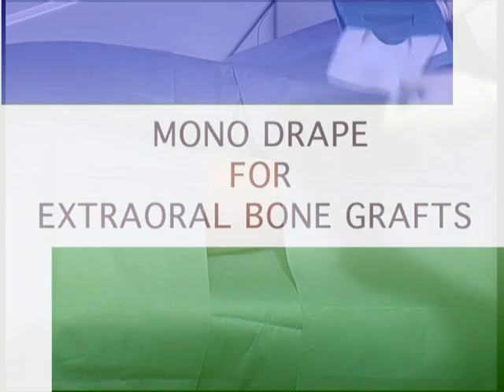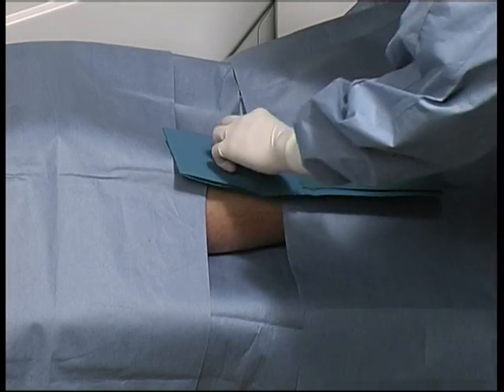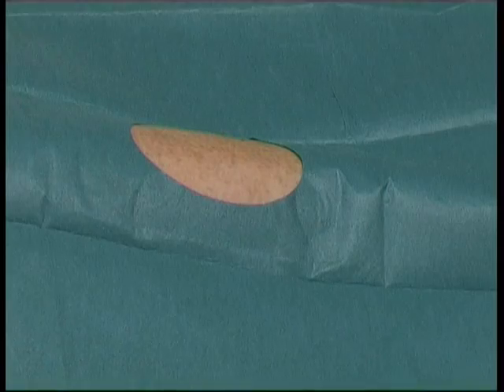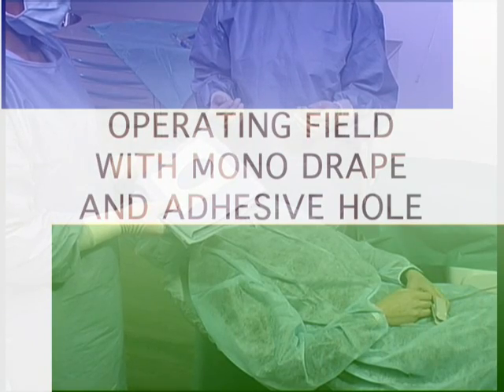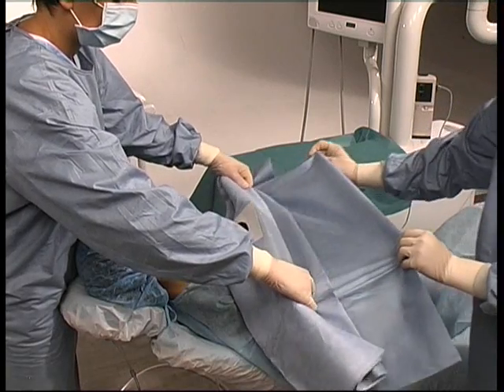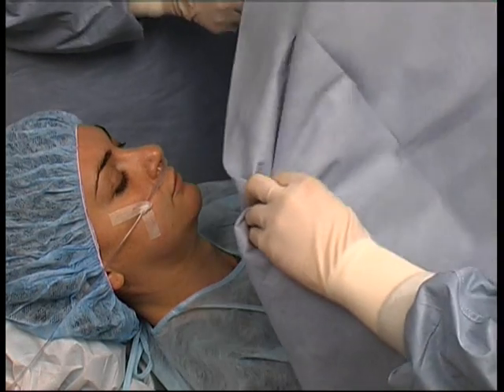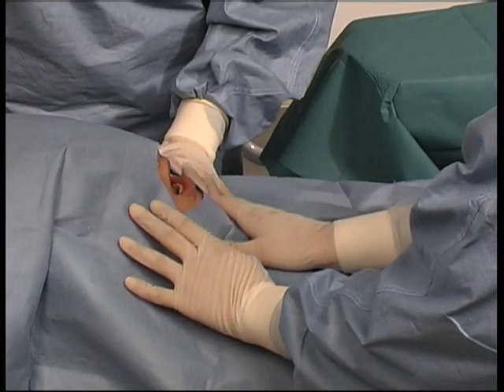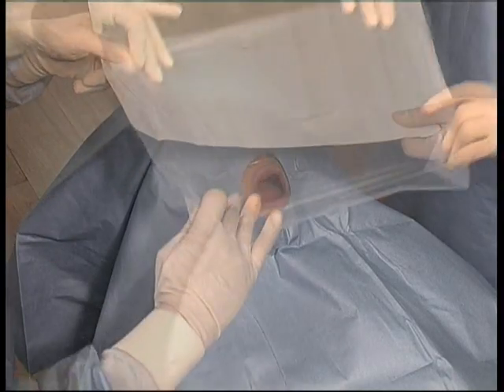For extra-oral bone grafts, if the operation involves such grafts, drapes with specific holes can be used to isolate the required area in the best way. For an operating field using a monodrape and adhesive hole, the drape is placed over the patient's chest and unfolded towards his feet. In this case, the patient must be attached to a suitable oxygenation and monitoring system. The protective strips are removed from the adhesive and the drape is fixed over the face. The sterile field can be integrated using a transparent incision drape.